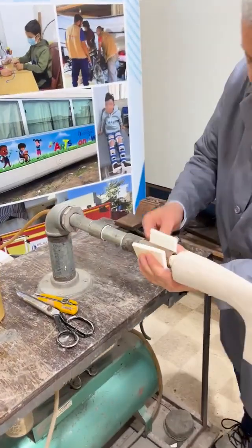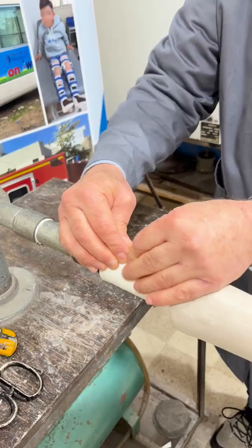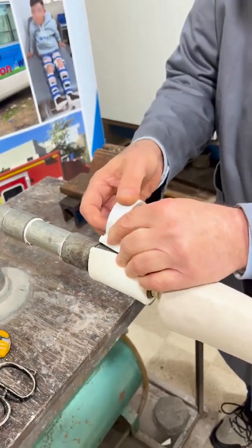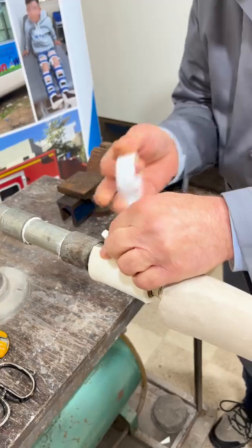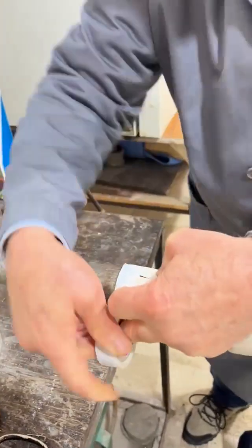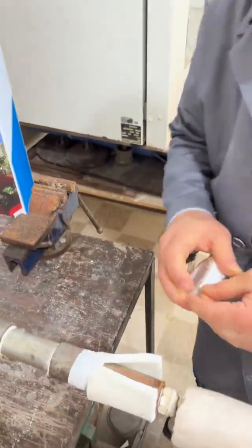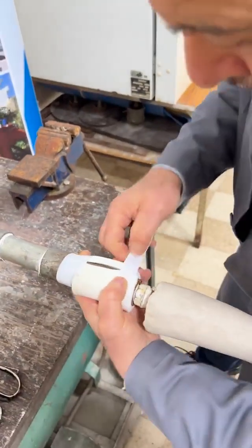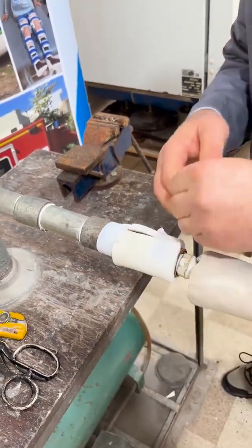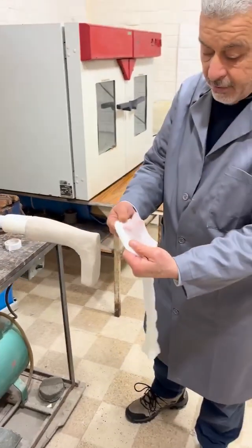Now we put this piece of volara just to have the plastic catch on it, and then it will seal better than without it. So this is what we do, like this — just seal it all the way, and then seal around here as well.